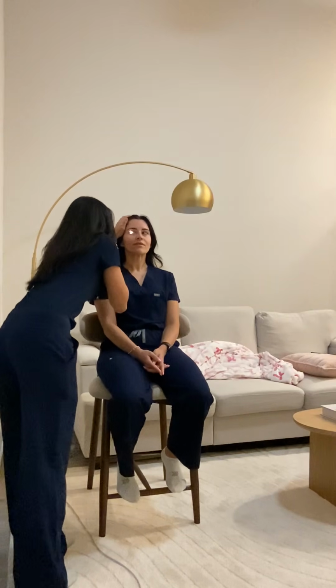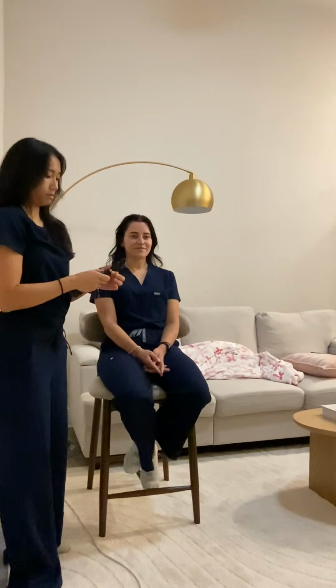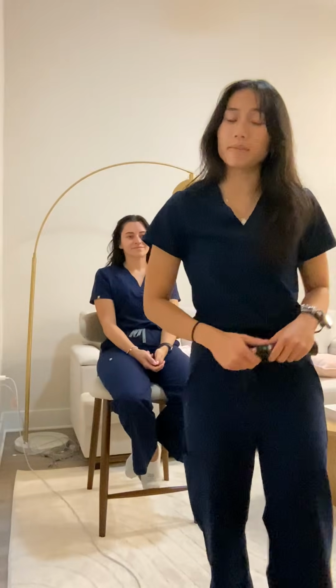Please look at the light, and I see the macula and fovea. Alrighty, and that concludes the eye examination. Now we'll be moving on to the ear.